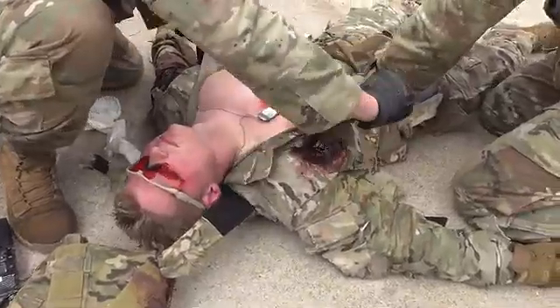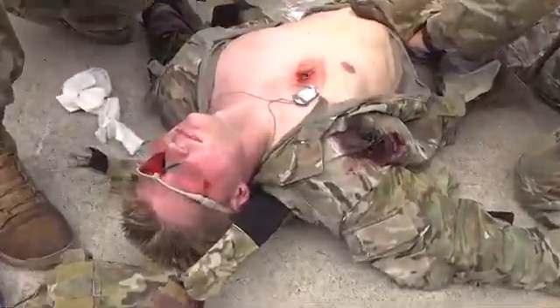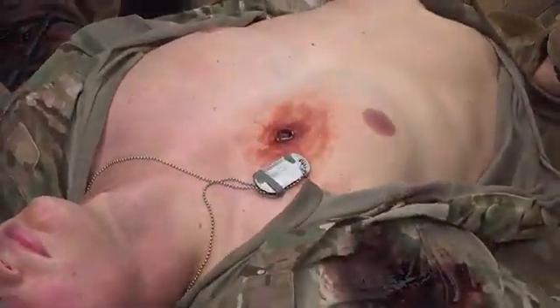Hello, I'm Brianna, an Air Force medic. I'll be teaching you how to perform a bilateral needle decompression of the chest. It is performed in a casualty with significant torso trauma or polytrauma with no pulse or respirations in the tactical field care phase.